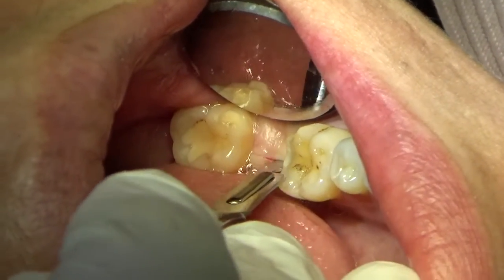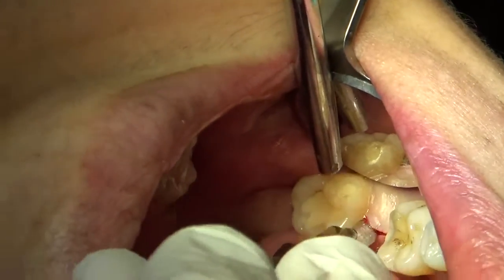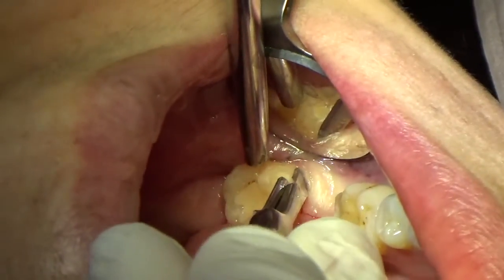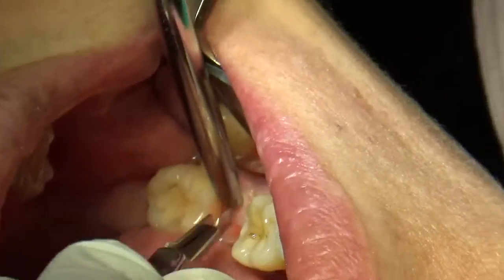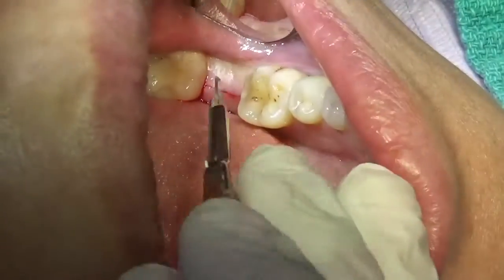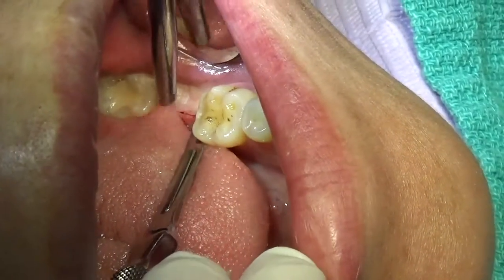So if we go nice and slow all the way across, what I'm doing is I'm taking my 15 blade and I'm feeling, making sure that there are no dips or concavities in there. So slowly going across. I had a professor once tell me that when reflecting a flap, know that all that periosteum belongs to the flap here. You can see well. So I'm going to retrace, just to make sure before I start to do my full thickness.